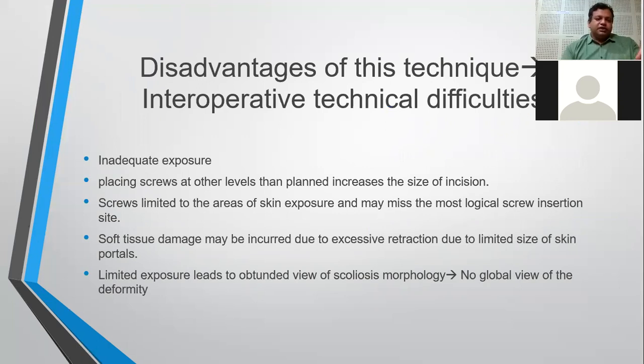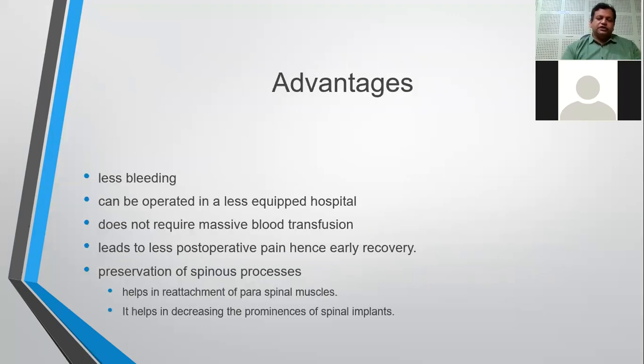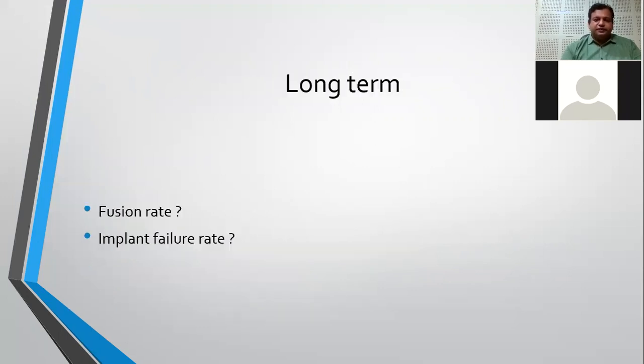So you can use C-arm, but they are spot views, so you don't get a global picture of the curve correction. Advantages are obviously less bleeding, can be operated in a less equipped hospital, does not require massive blood transfusion. It leads to less postoperative pain and hence early recovery. And preservation of spinous process has a dual role in helping in reattachment of paraspinal muscles and it helps in decreasing the prominence of spinal implants.